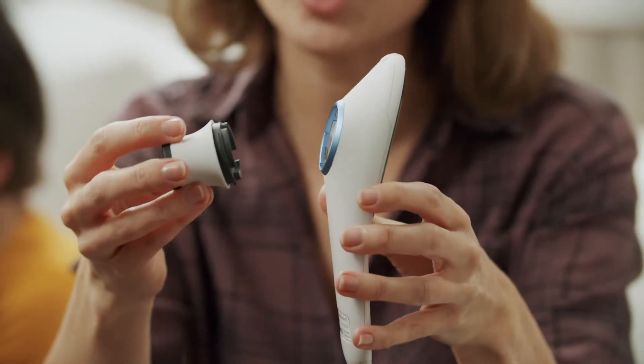Hi! See how easy it is to measure the temperature with HiGo, though it may be a little different than you normally do. Attach the thermometer module.